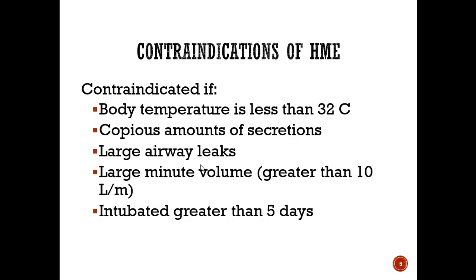If you have copious amounts of secretions, we are not going to use an HME. And the big reason for that is the HME only does about 30 milligrams per liter of output. It's not nearly as effective as heated humidity.